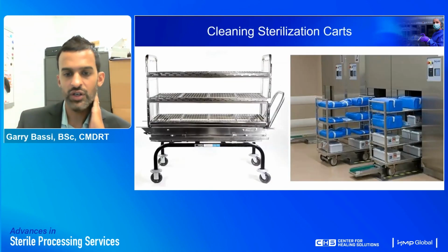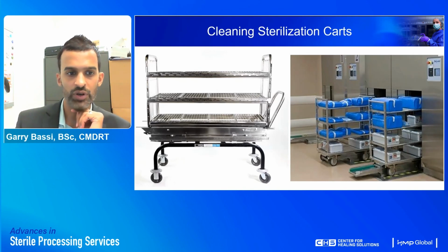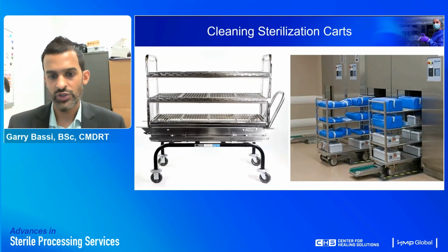Cleaning your sterilization cart is similar to the chamber. Again, it's another challenge that could cause your packs to be contaminated by transferring contaminants from the cart to the packages. So upkeep them and make sure they're nice and clean. Some of them can be run through the cart washer. Some of them can be cleaned the same way as your chambers.